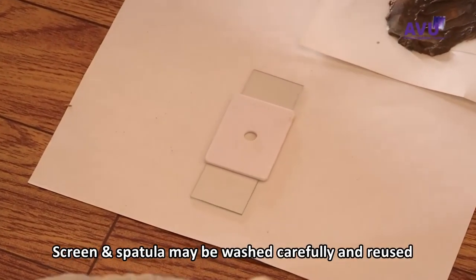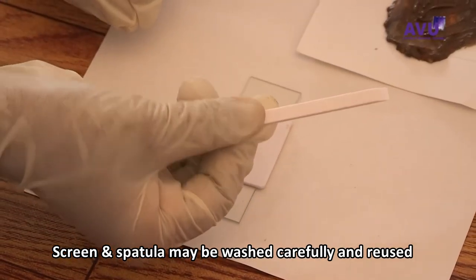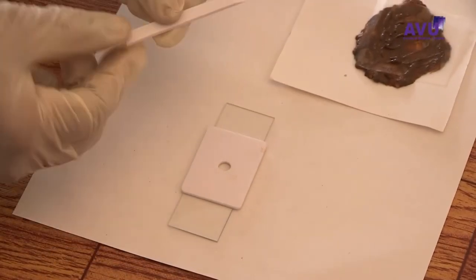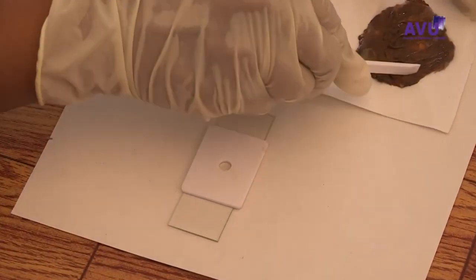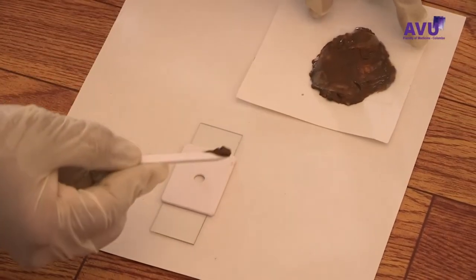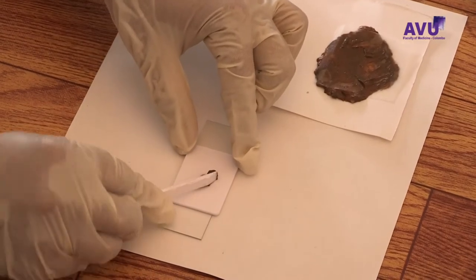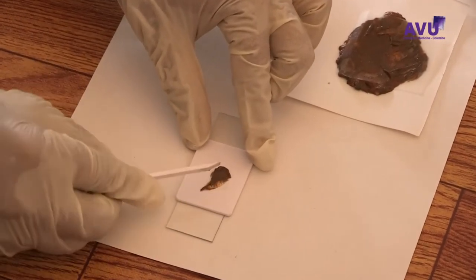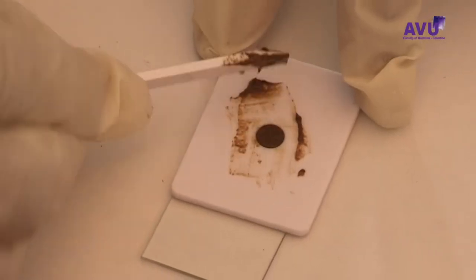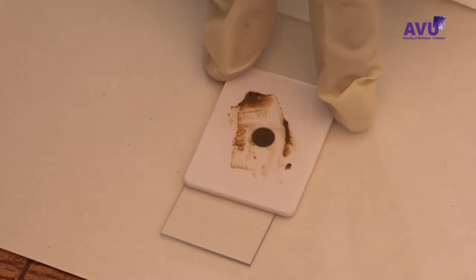Using the spatula, scrape across the upper surface of the wire mesh or screen to collect the sieved faeces. Add sieved faeces until the hole of the template is completely filled. Pass the edge of the spatula over the hole to level off and remove any excess faeces.